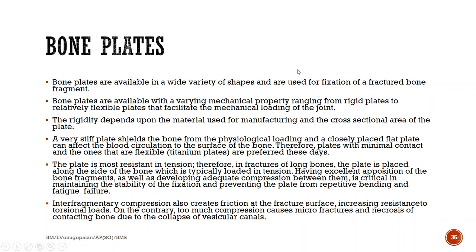Again, a very stiff plate shields the bone from physiological loading. Whatever load the bone is supposed to undergo is being shielded by the plate because it's very rigid. It's taking over the function of the bone. So the bone is just lying there idle, not doing the work that it is supposed to do, and that would affect the overall health of the bone.